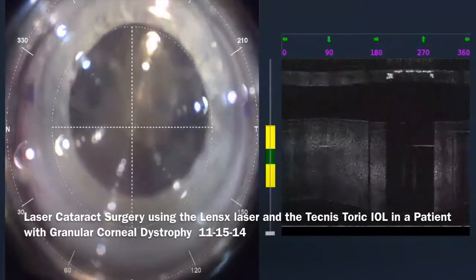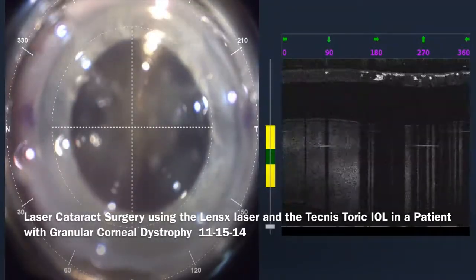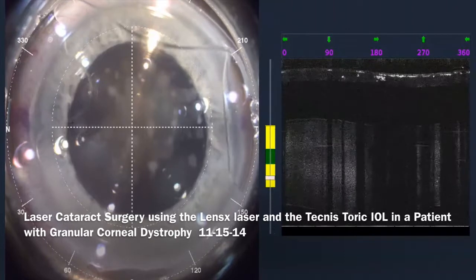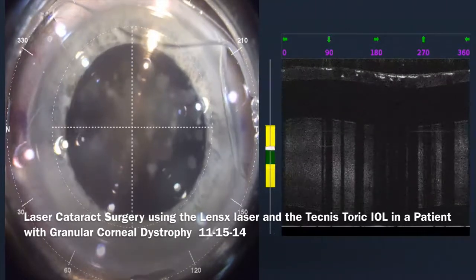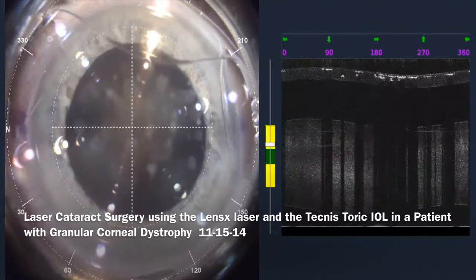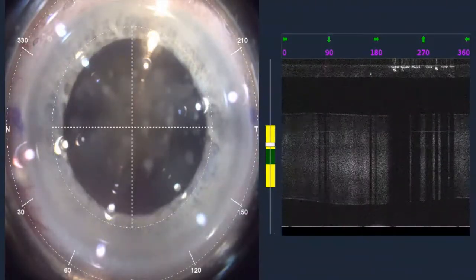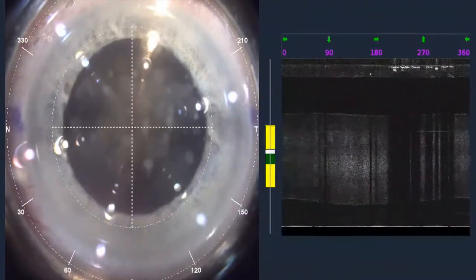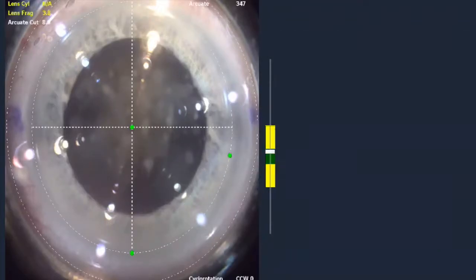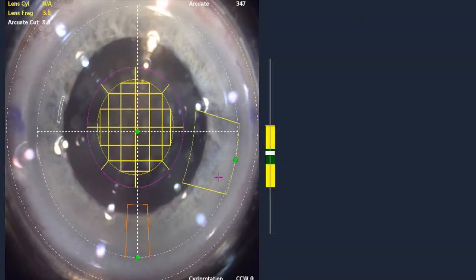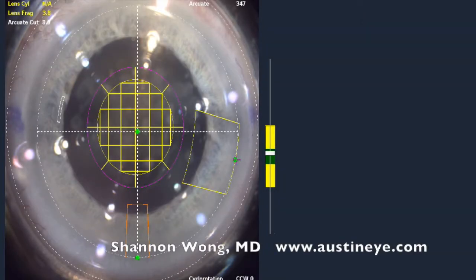Hi, this is Dr. Shannon Wong. I'm going to describe a case of laser cataract surgery using the Tecnis toric, or astigmatism correcting, lens implant in a patient with granular corneal dystrophy.